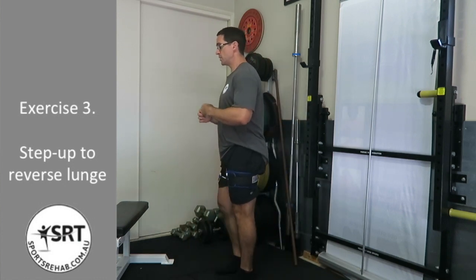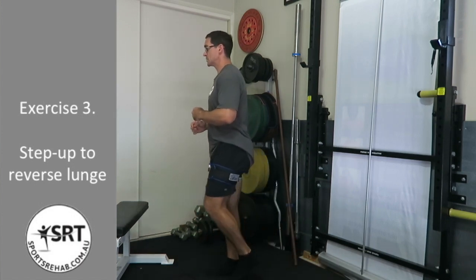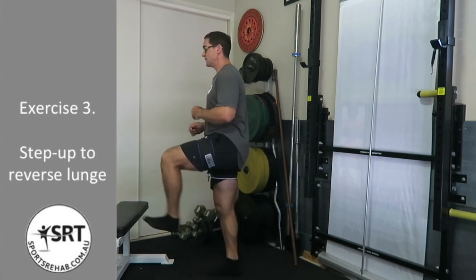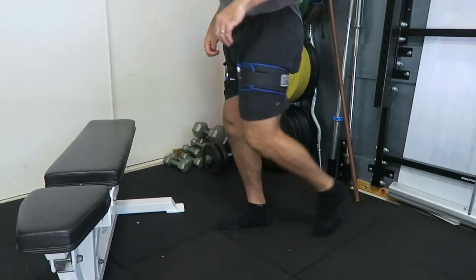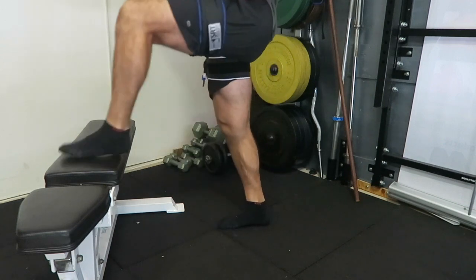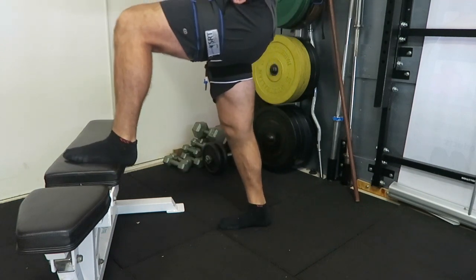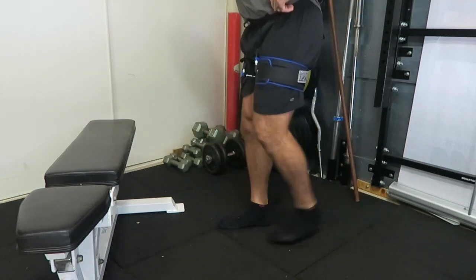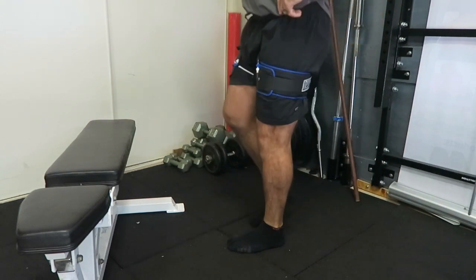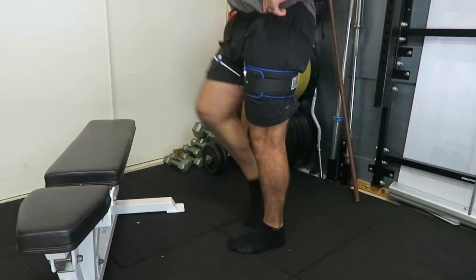The third movement is just a step up, and I find this really useful for a good muscle motor pattern as well. Because my right knee is stiff, I'm not able to get that same range of movement, as my heel will want to come up in a forward type movement, so this would affect my running technique. Now I'm on to my worst knee, and as I'm stepping back, I'm working more range, thinking about bringing my heel up to underneath my butt as I'm coming through.